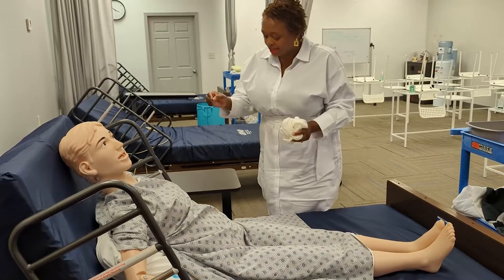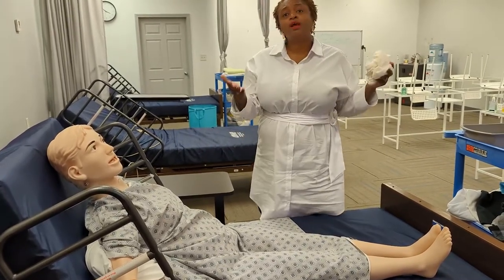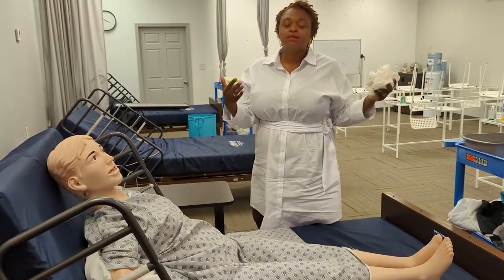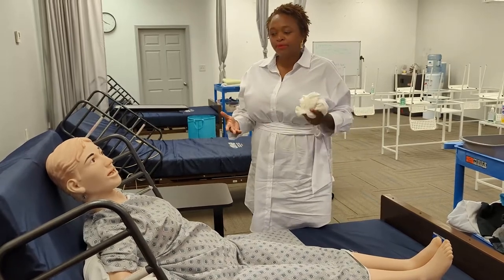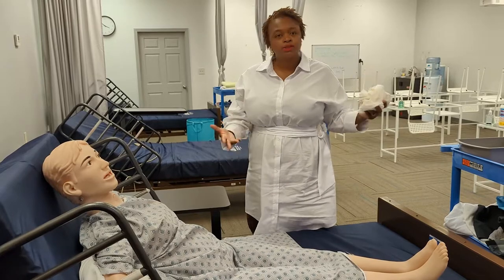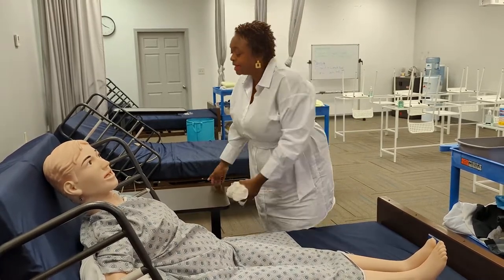Is that all right? Can I see your two patient identifiers? Now in real life, I would wear gloves. If you're doing this for the CNA testing in the state of Massachusetts, you might not have to wear a glove, but in real life someone could have a cut on their skin, so I would put gloves on — a lot of times you might inadvertently pinch the patient's skin.